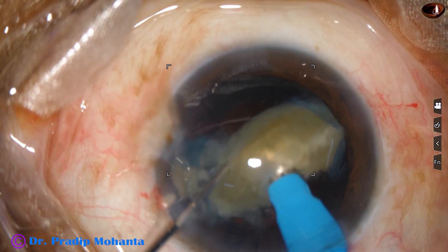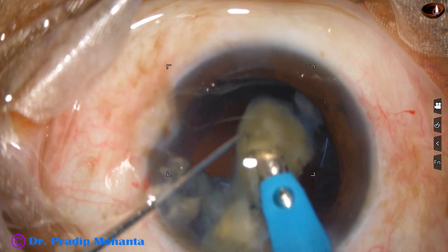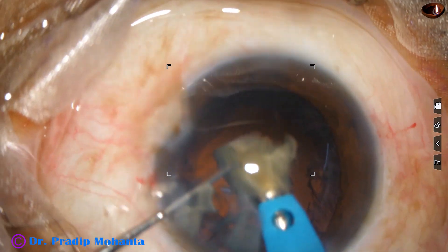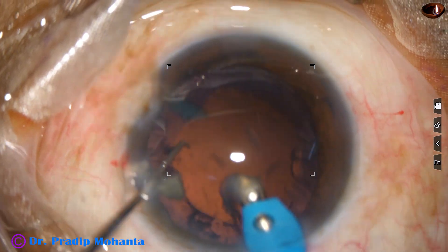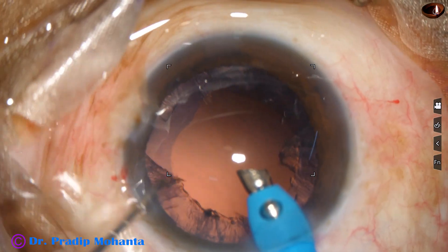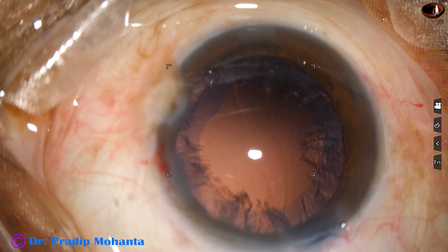This is the hemi-nucleus — it has been divided into two halves and now it is being emulsified. The pieces are being emulsified. Ultrasonic energy used in this case is 65 percent, flow rate is 45 ml per minute, vacuum is 450 mmHg. During emulsification of the last piece, the parameters are reduced to 350, 35, and 60.